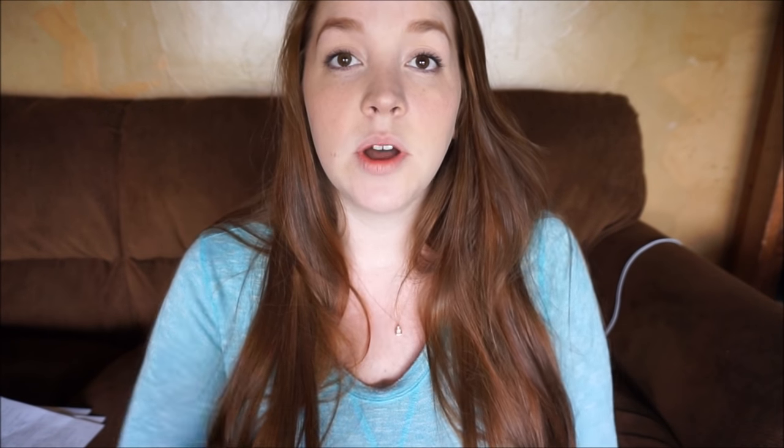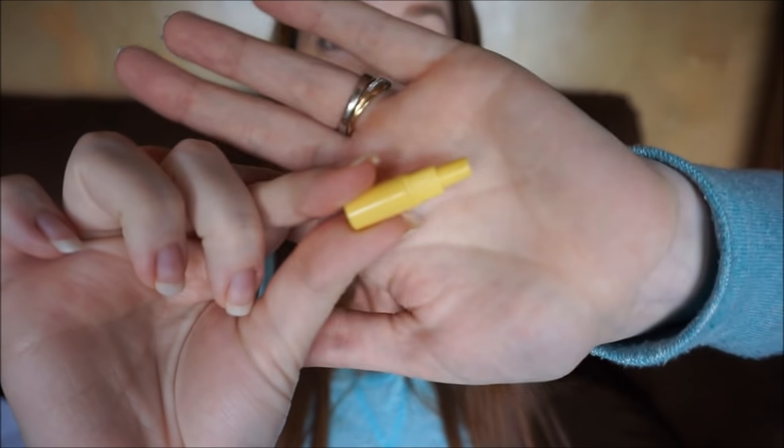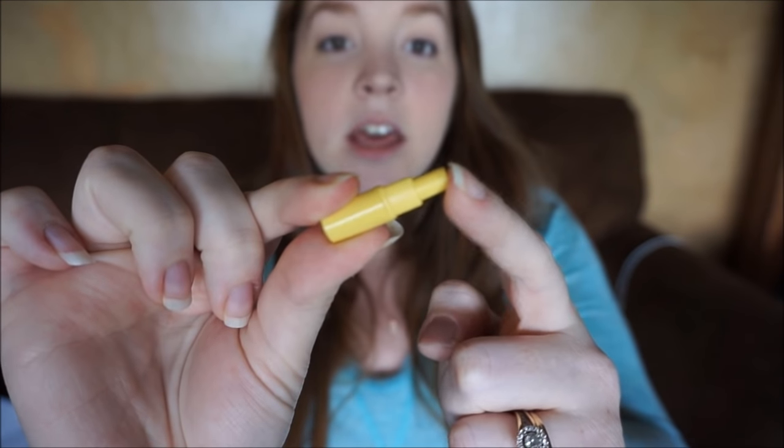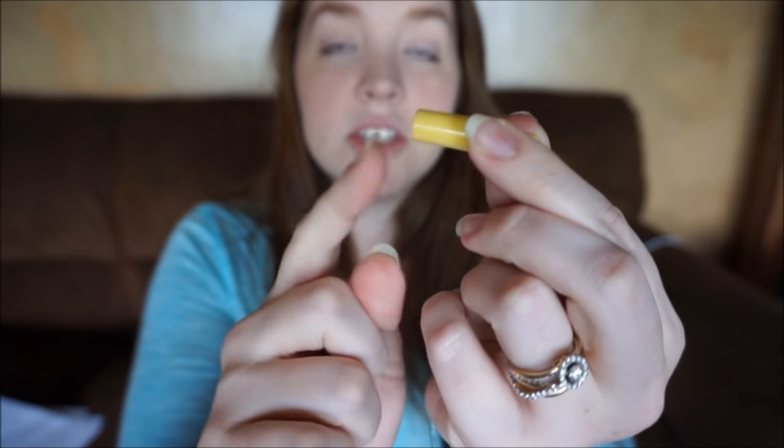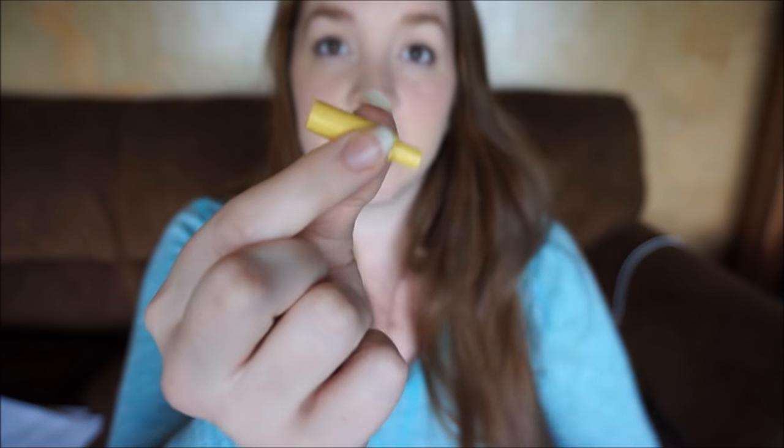There's a little adapter that Maymom makes where this end slips into the back of your Medela parts and then connects to the backflow protector of the Spectra. As an exclusive pumper, I had a ton of Medela parts and I didn't want to buy them all over again — so this allows me to use my Medela parts. It cost me about $10 with shipping for two of them. I will leave a link to that down below.